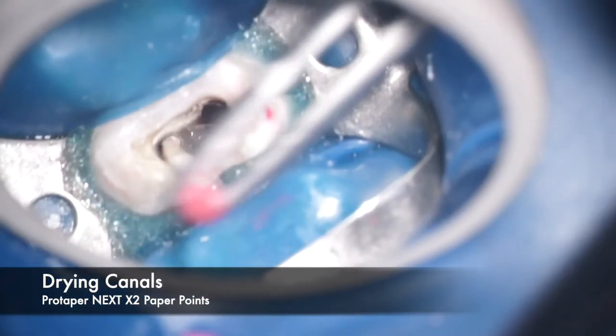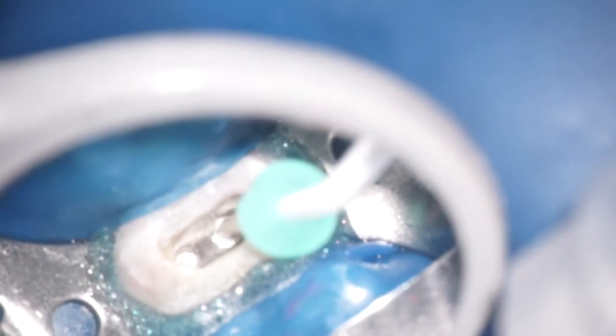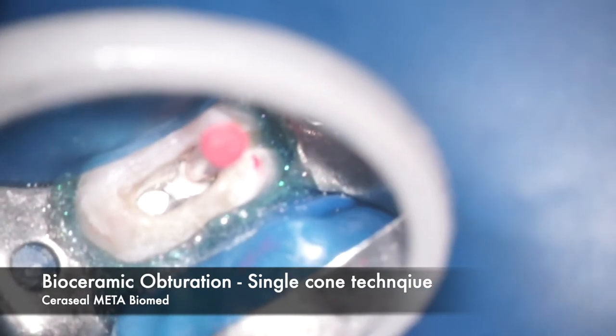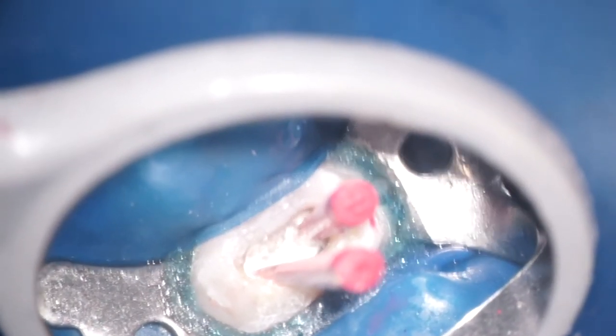After gauging is completed, we take a radiograph. The obturation technique we are going to use is with the bioceramic sealer known as Ceraseal from Meta Biomed. You can see as I'm injecting the sealer into one canal, it has already flowed into the palatal canal as well — that's because of the excellent flow properties of this sealer. With this type of sealer, you use only a single cone as the obturation core material.